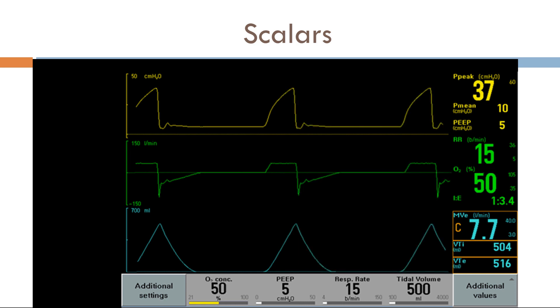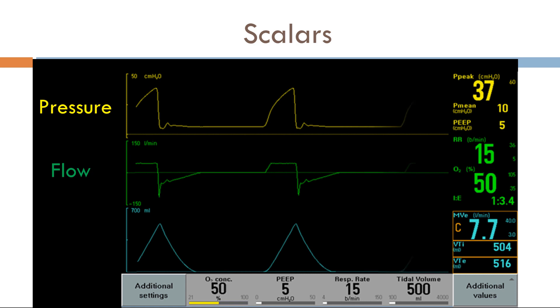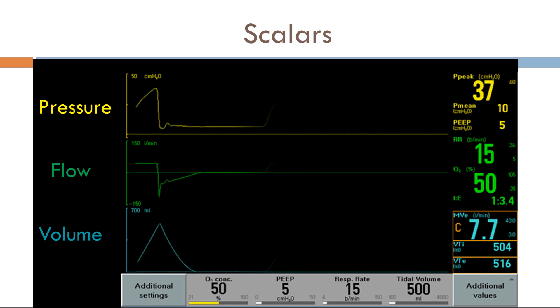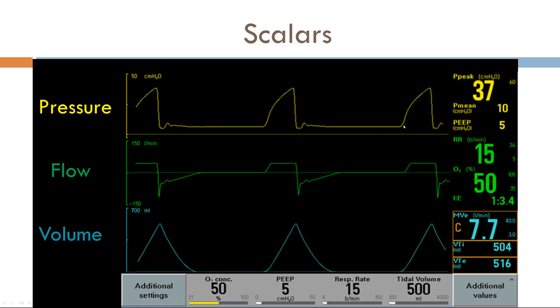The first thing we see here are scalars. This is typical of a mechanical ventilator to show all these different waveforms. The first one is a pressure time scalar, or pressure scalar. The second one is a flow time scalar, or flow scalar. And the last one is a volume time scalar, or just a volume scalar. These are not loops — loops are something different, and we'll get to loops later. The way to read these scalars can be overwhelming at first. Just as there's a systematic way to read chest X-rays, EKGs, and ultrasonography, mechanical ventilation is no different. I highly suggest reading each scalar from left to right individually — look at the pressure scalar, read it left to right, same goes for flow, same goes for volume. Much better reading left to right compared to up and down.